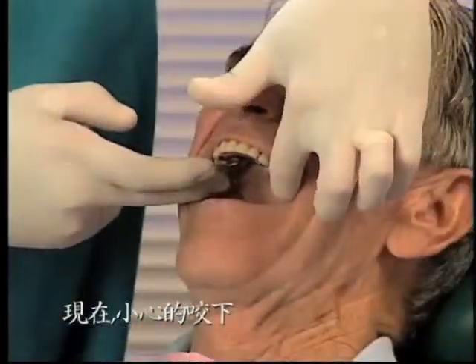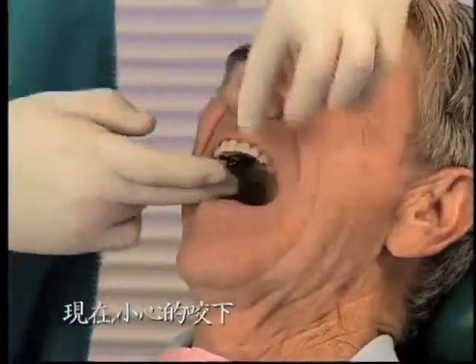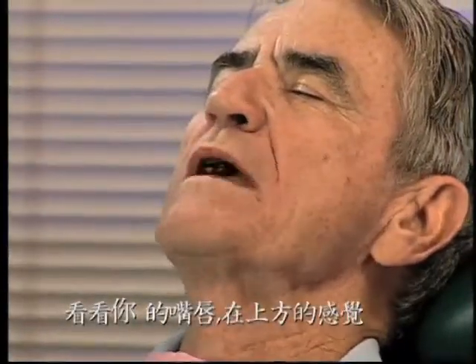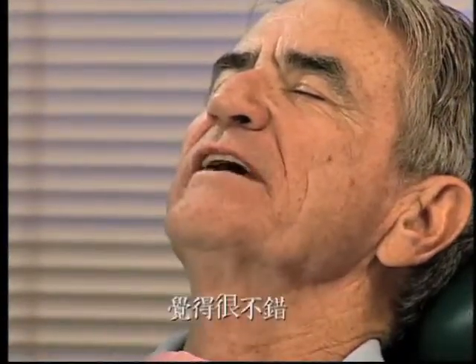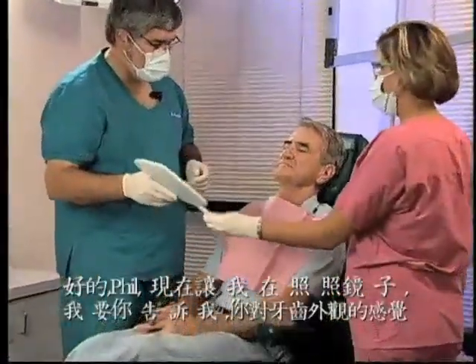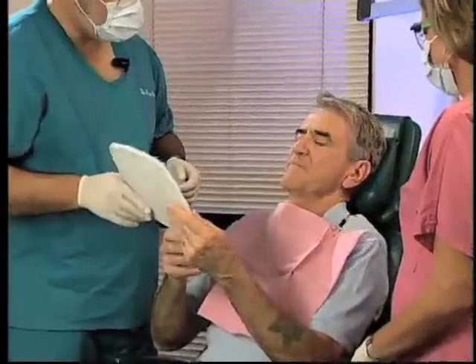Okay? All right. Okay, now carefully bite down. Then I want you to let me know how they feel. Run your lips across the top of them. Feel very nice. Okay, Phil, let's look in the mirror now, and I want you to tell me how you feel the teeth look.